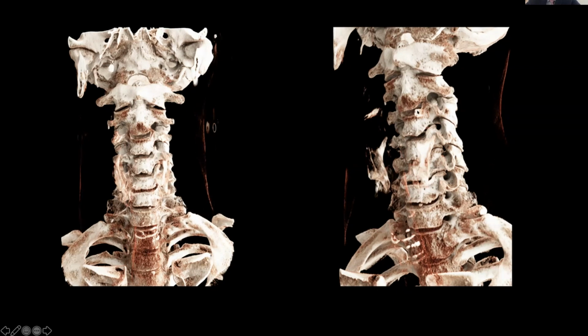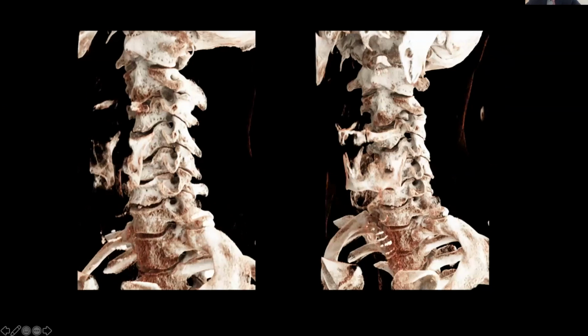But I think this really gives you a good sense of what the uncovertebral joints actually look like, and why their hypertrophy may contribute to the narrowing of those nerve roots. And how those uncovertebral joints relate to the vertebral body itself, the neural foramen, and of course the facet joints at the back, whose hypertrophy may also contribute to the narrowing of these nerve roots.